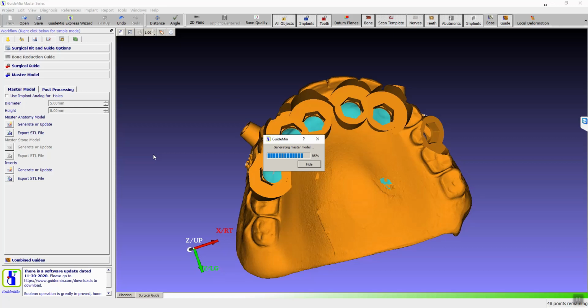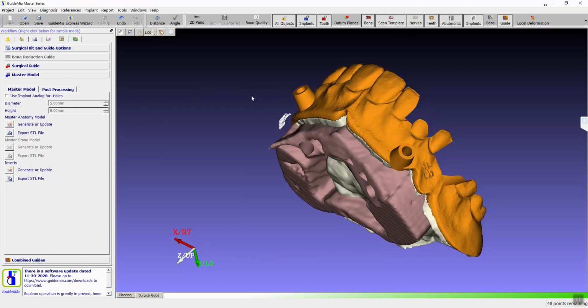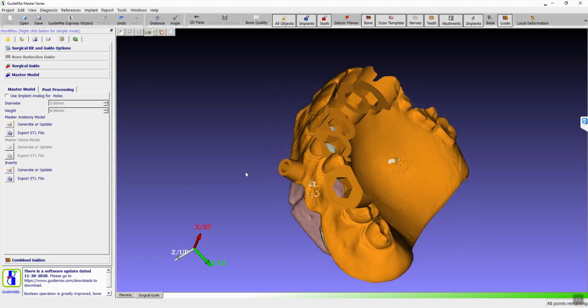You know, Brian, for the single unit case, I kind of like what those two guys, Jeff Moy and what's another guy's name? They went to GuideMia too, if you remember. They have the Lucy guide, single unit. You don't need an optical scan. You take the impression. Oh, yeah, that's Dr. Aboud. Marcus, yeah.